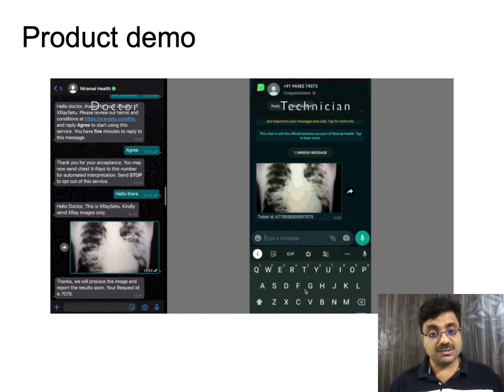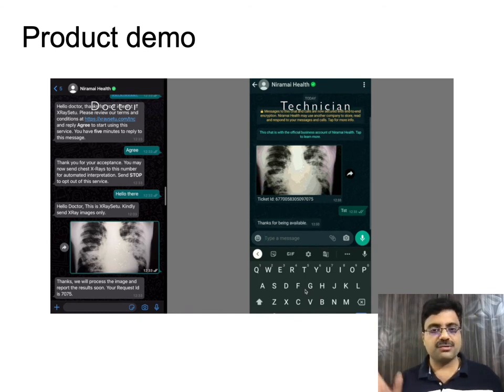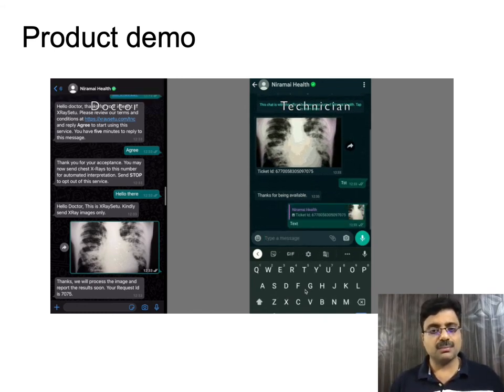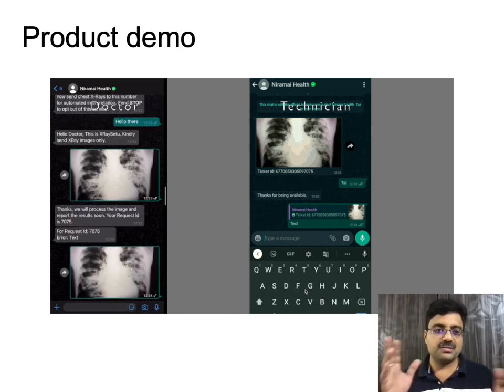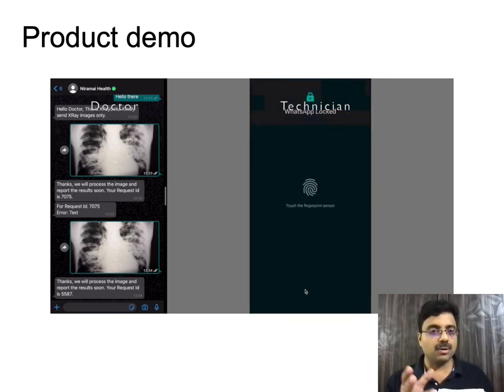we ensured that the image was sent for manual review. The service has a roster depending on the time of the day. So the technician gets a notification, they're logged in, they signal their presence to the system by starting a simple WhatsApp session. So the system knows they're available, they get a notification. And at some point of time, the technician will simulate a typical manual review step, which is maybe cropping the image, adjusting the brightness or something. And the technician sends it back to the service after the edits to make it slightly higher quality.